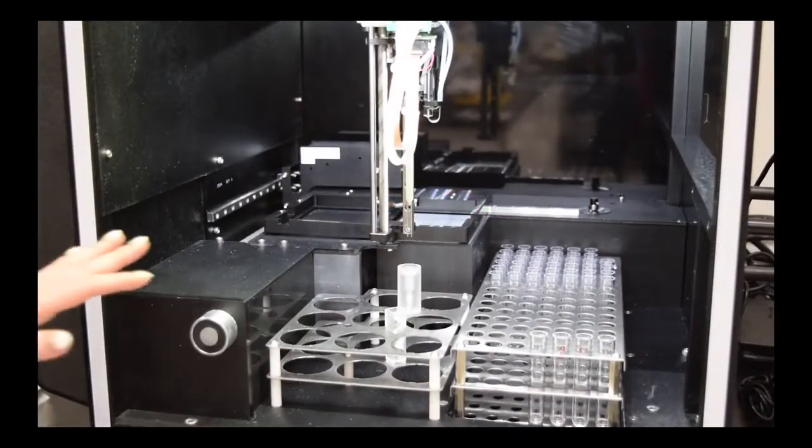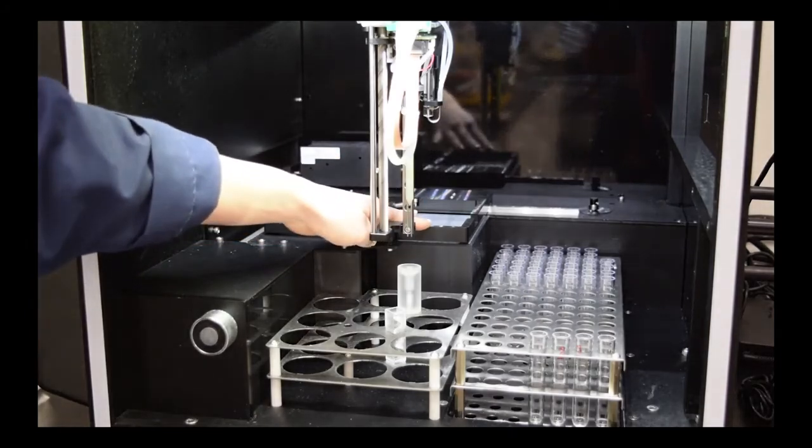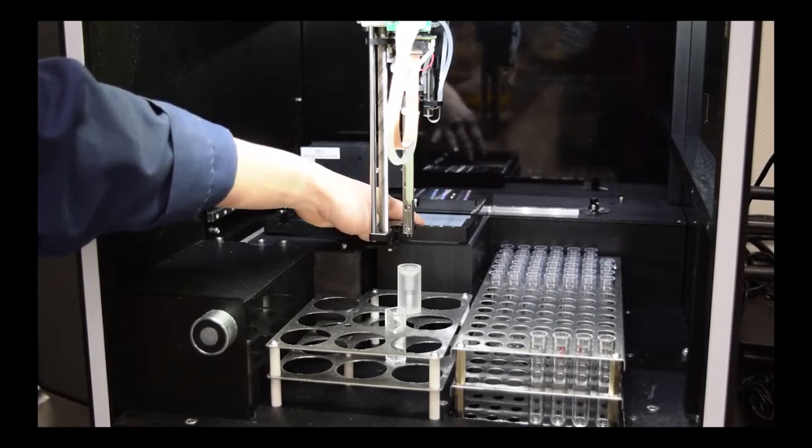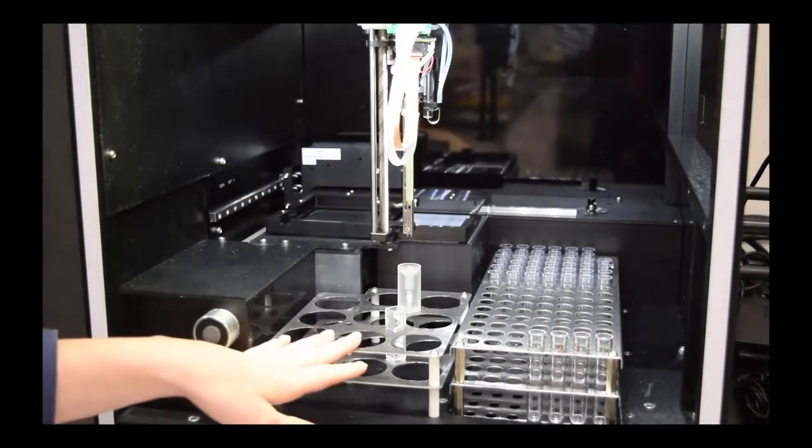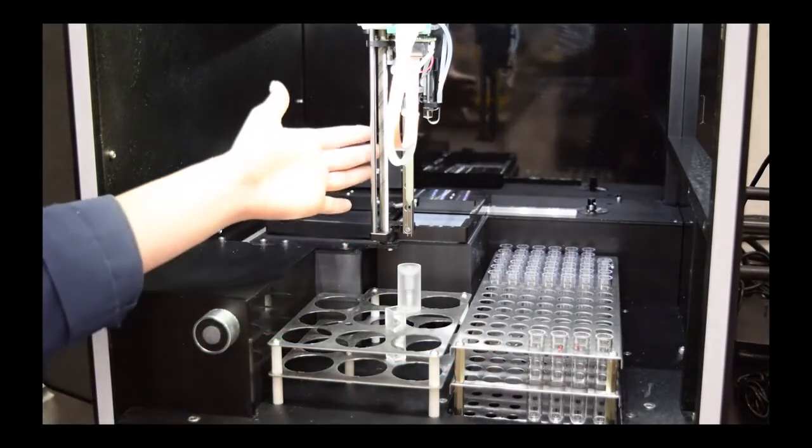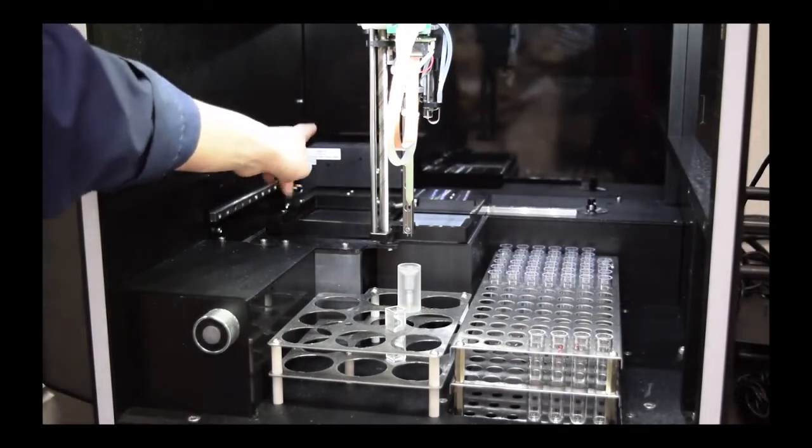Inside the instrument we have the plate platform, an extra plate slot for an intermediate plate, an incubator to incubate your plate up to 40 degrees Celsius if desired, a reagent rack, the sample rack, the probe, and an LED plate reader that comes equipped with five different wavelengths.